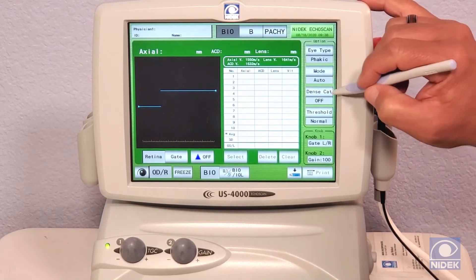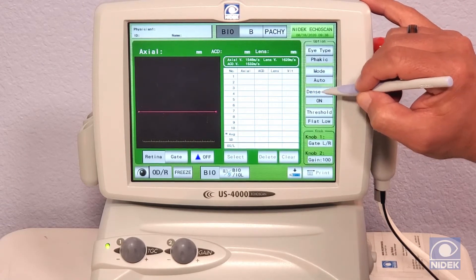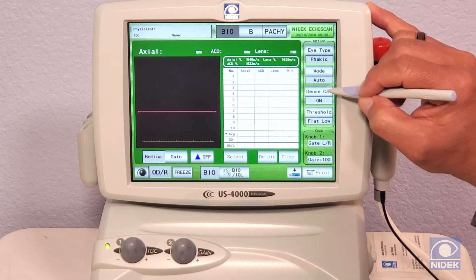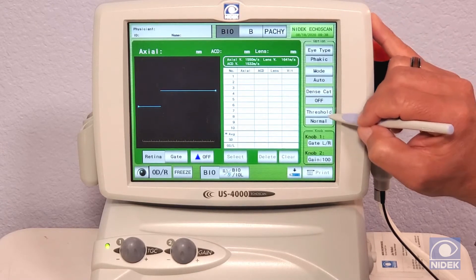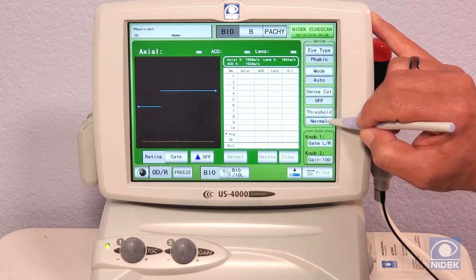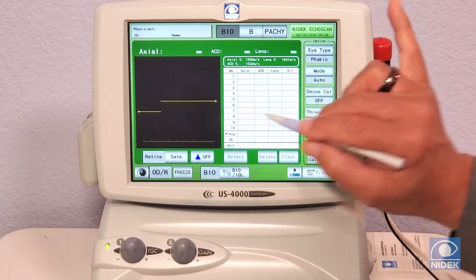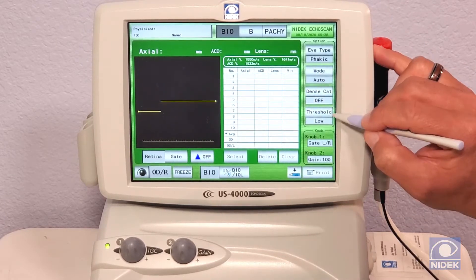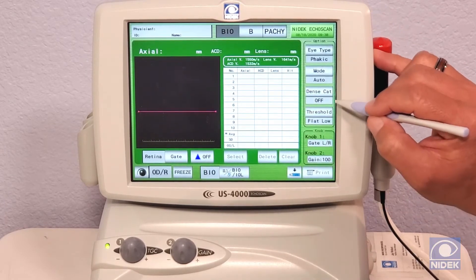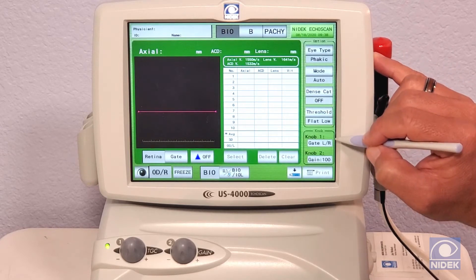We also have a dense cataract mode, which when pressed is going to give you a flat low threshold. The thresholds we have are normal, low, and flat low, which is the same as dense cataract.